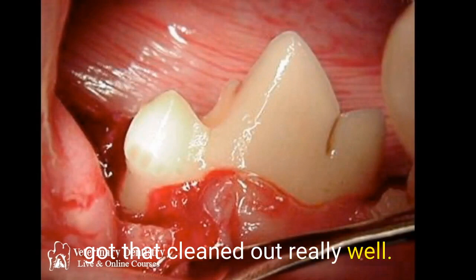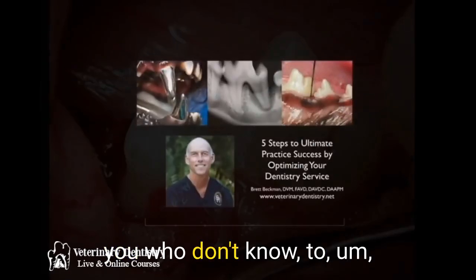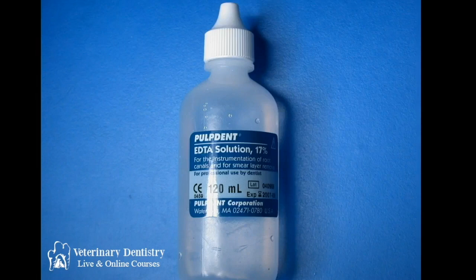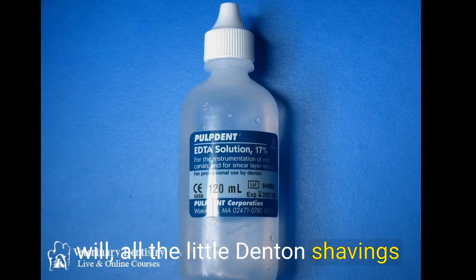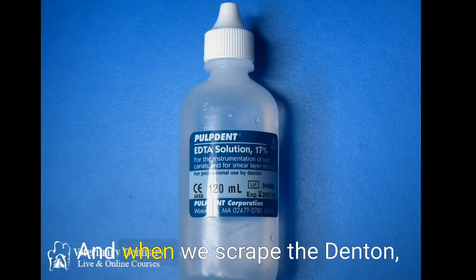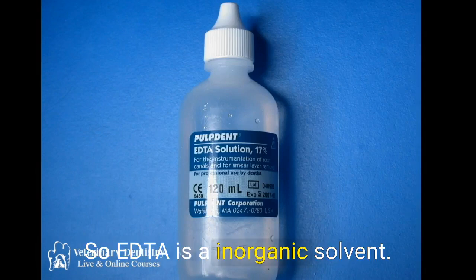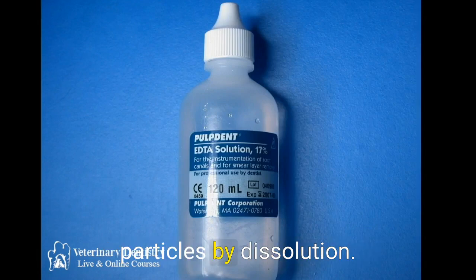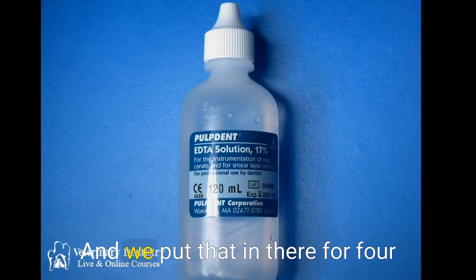Once that's done, you can use EDTA to remove the dentin mud — all the little dentin shavings that occur when we clean, because we're scraping dentin material down into the tubules. EDTA is an inorganic solvent, so it will remove those little particles by dissolution from the tubules. We put that in there for four minutes and then rinse it out.